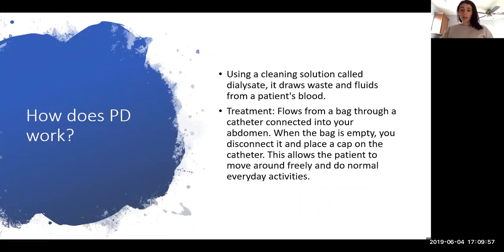How does PD work? Using a cleaning solution called dialysate, I'm probably pronouncing that wrong, it draws the waste and fluid from the patient's blood. So it flows from the bag, as we saw in the last picture, into the catheter connected to your abdomen.